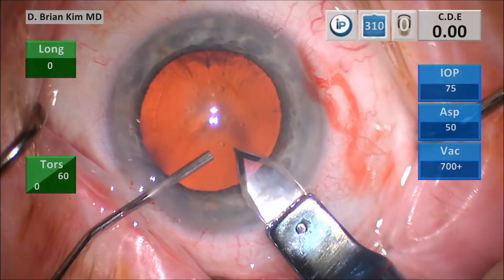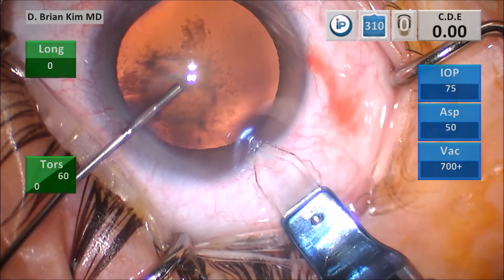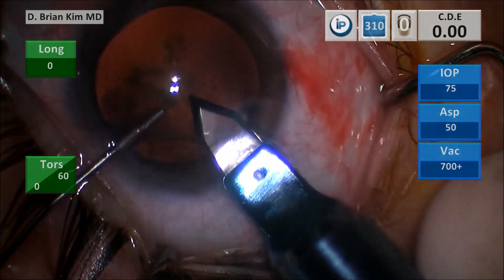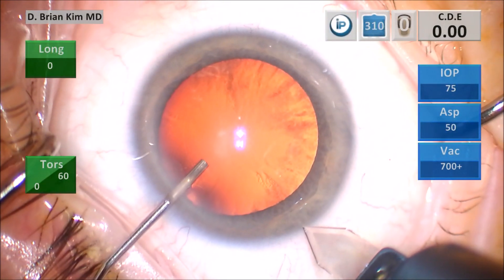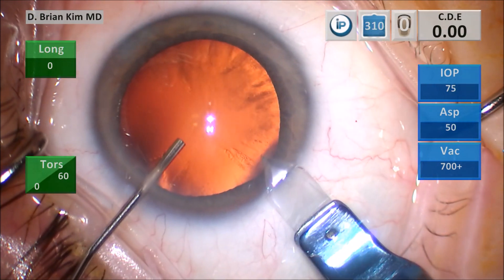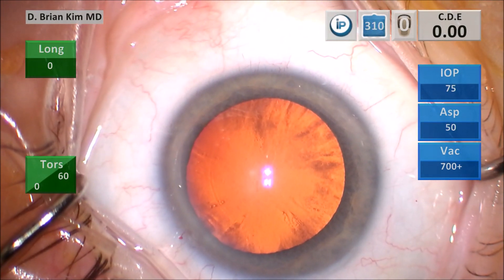A lot of these maneuvers are quite subtle. I'm using my cannula to do some of this work. I'm going to make my incision and then use the cannula to push the eye away from me, which helps me make my groove from my angle. Then I use the cannula to pull the eye toward me so I can actually puncture. You'll see the cannula move the eye — first the eye is straight when I make my vertical groove, then when I make my tunnel I push the eye away, but when I'm ready to puncture I bring the eye back toward me and puncture through.